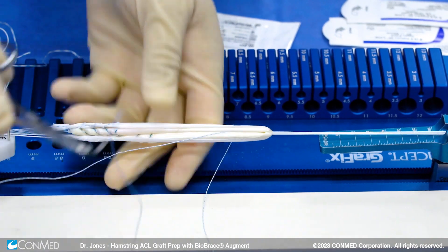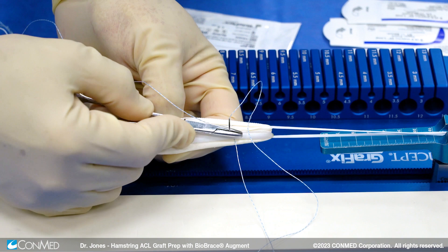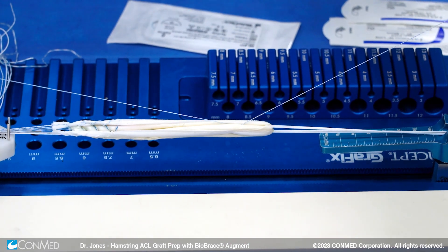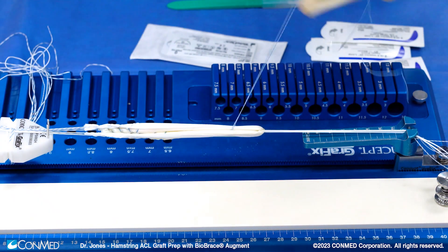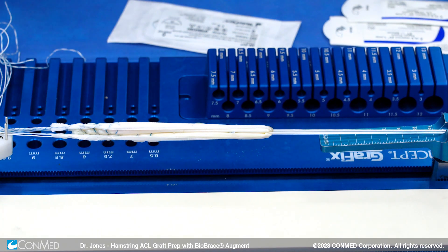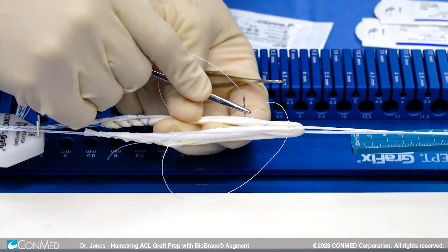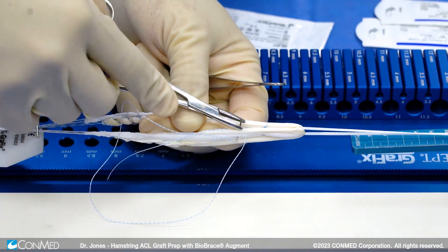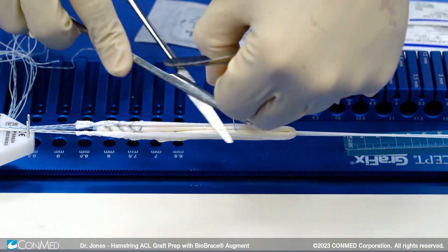Now the suture is going through all four limbs, and then one final throw — open it back up between the four limbs, come on the opposite side through the biobrace and through the allograft tissue, then come up in between. As I come up in between, that's going to dunk the knot, but I'm able to maintain the tension — it just dunks the knot in between the four limbs of tissue, and you see the knot is not present on the surface. I'm still at plus 20 pounds of tension. Doing one more time: go to my side first, do the biobrace and allograft on this side, go through one, two, three, four, then come back between again to dunk the knot, lay the knots down as you would with any standard suture technique. Four throws usually for me, cut the sutures, and the graft is repaired.